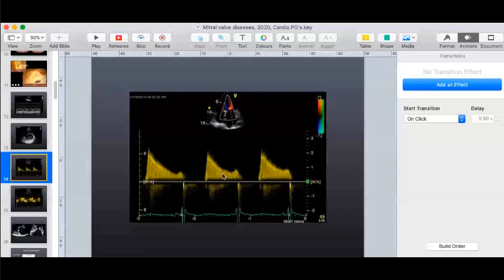So what are the problems associated with this method in terms of measuring the mitral valve area? Associated valvular lesions like MR, AR, and AS, any associated valvular lesion can underestimate or overestimate the mitral valve areas. Atrial fibrillation, although we can average the readings, sir, but it's not reliable. Tachycardia. Do you think mitral regurgitation will alter the slope? Sir, flow across the mitral valve will increase.